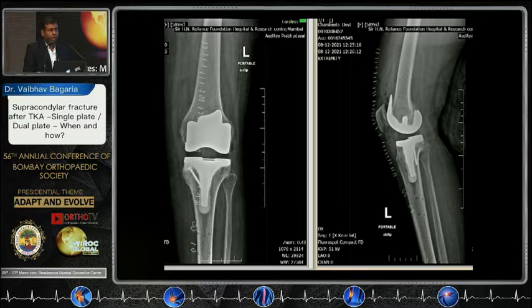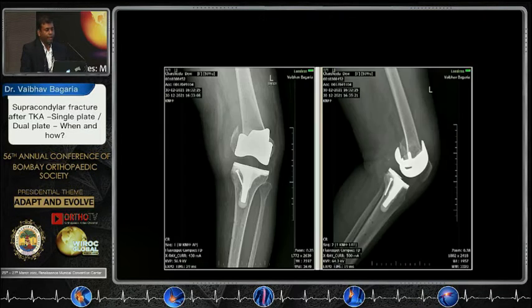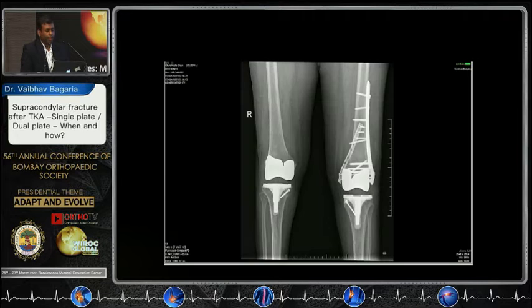We did it robotically, and one of the reasons for increased periprosthetic fractures, in which we may see an epidemic, is the use of robotic technology. My own case where we did this, you'll see the pin placement track there, and 4 weeks post-op, this is the X-ray, we had a periprosthetic fracture subsequent to the pin placement.